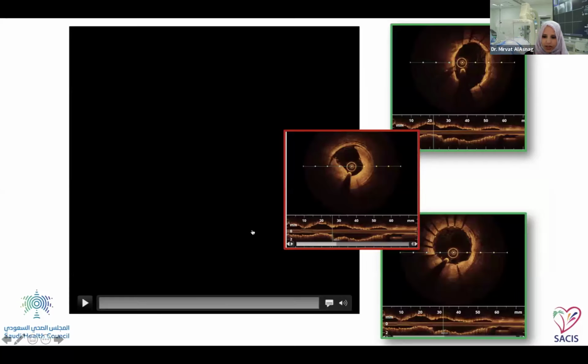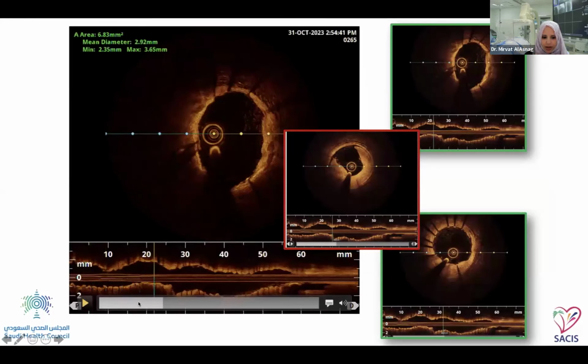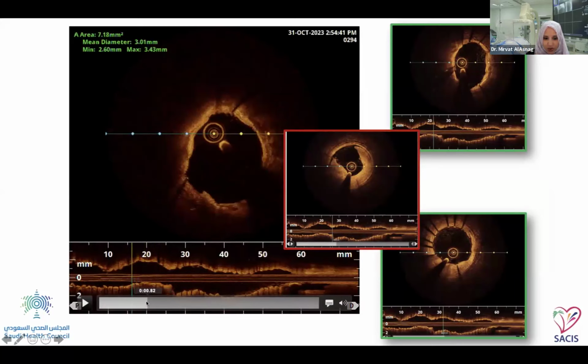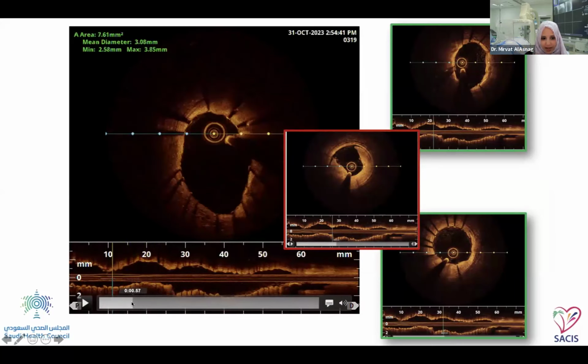And now we've deployed our stent, but look at what we see. So I'm going to keep going, and I tried to freeze frame for you. You do see the green part, you do see some stent, then you don't see stent here where the red part is, and then you see stent again. So actually we had a gap. So you do see stent, you do see some expansion and so on, and you need to go through the usual steps, right?